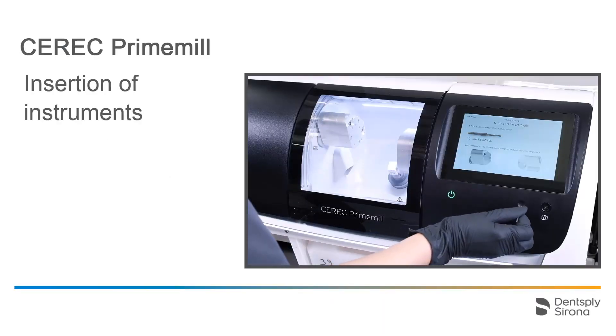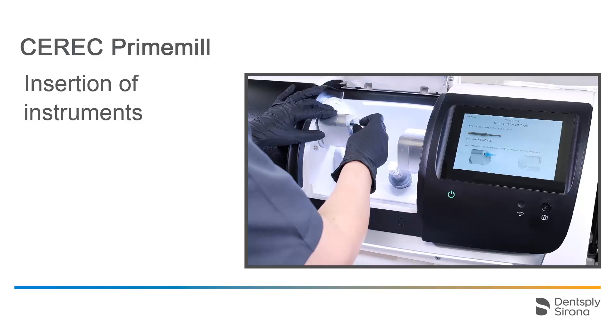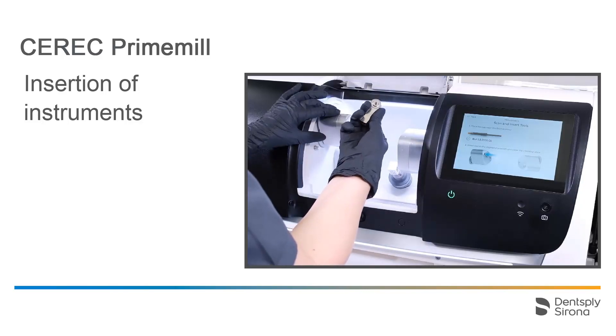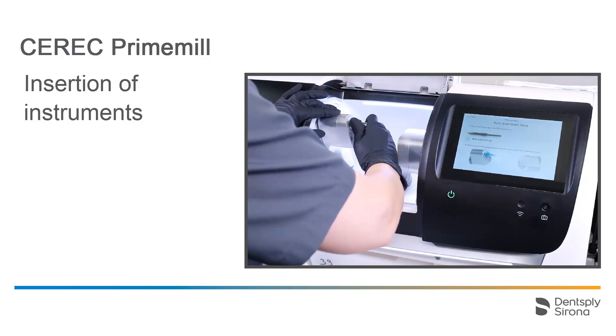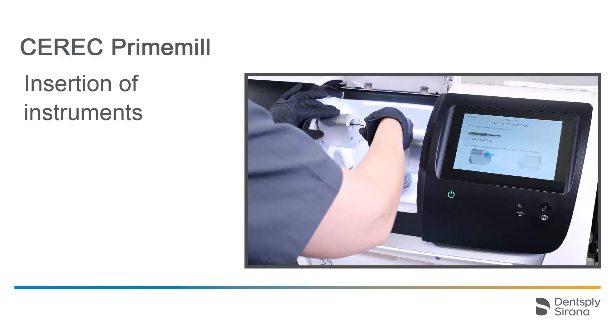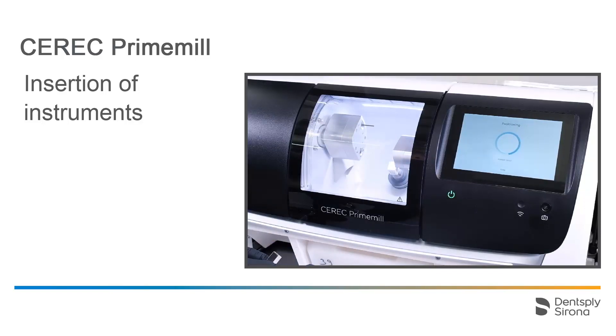We guide the color-coded end of the first instrument onto the scanner, and if this is the correct choice, a green check mark is displayed on the interface. If the wrong instrument has been selected, an error message appears. We open the chamber and hand-screw the instrument onto the indicated motor. As mentioned earlier, each instrument must be tightened with the matching torque wrench. After mounting an instrument, we close the chamber, and information about the next step is automatically displayed. In this way, the motors are equipped step by step.